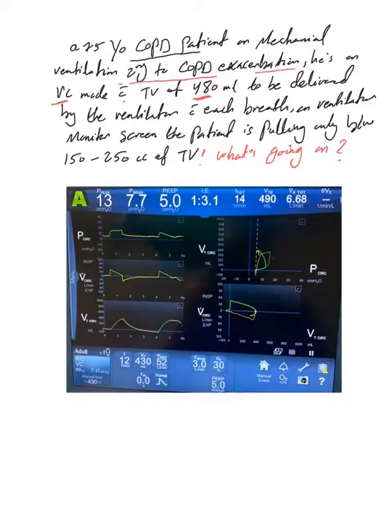And this image is just to show you something, but let's follow: 480 ml to be delivered by the ventilator with each breath. On the ventilator monitor screen, the patient is pulling only between 150 to 250 cc of tidal volume. What's going on?